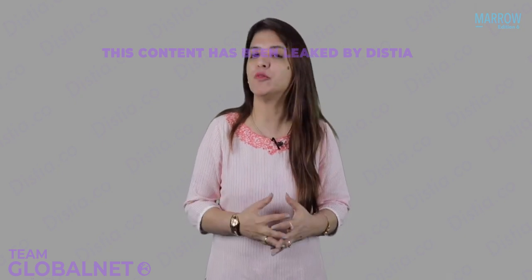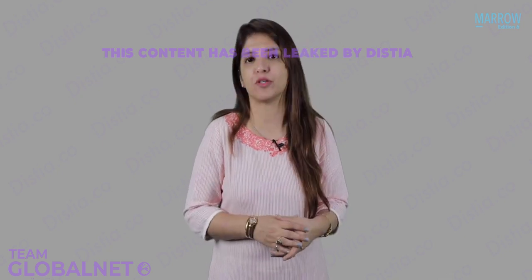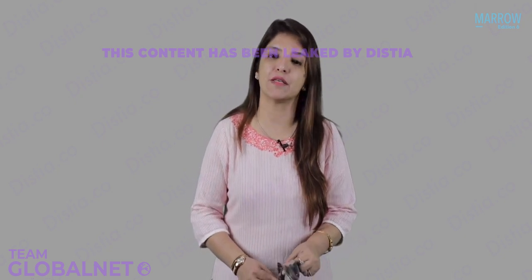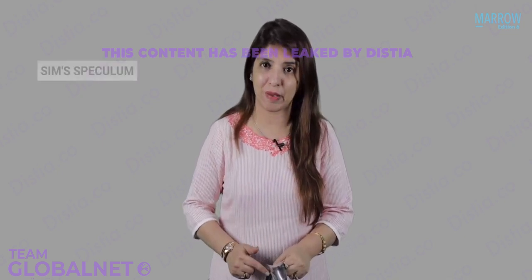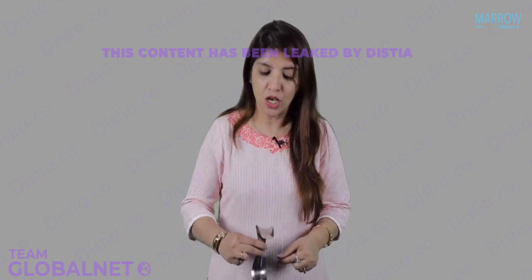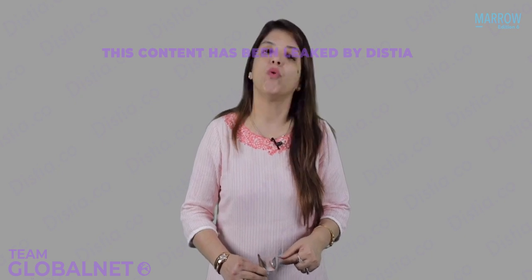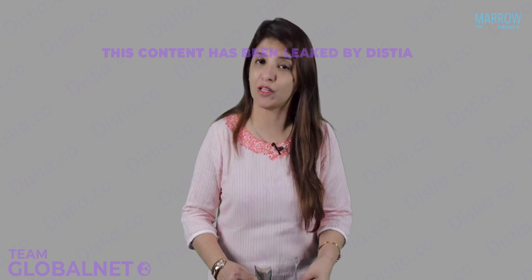See, I will be able to do an IUCD only if I do a per speculum examination. And whenever you have to do a per speculum examination, the first instrument which you need is a Sims speculum. This in my hand is a Sims speculum. Sims speculum is a non-self-retaining speculum. It is double-bladed, right? And it is used for retracting the posterior wall of vagina. So with the help of Sims speculum, I am going to retract the posterior wall of vagina. Once I have retracted the posterior wall of vagina, I have to retract the anterior wall of vagina.